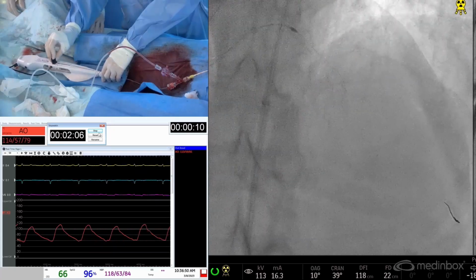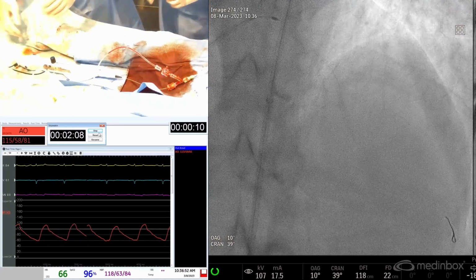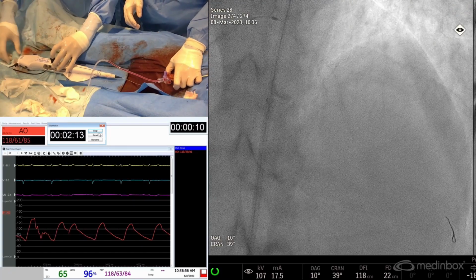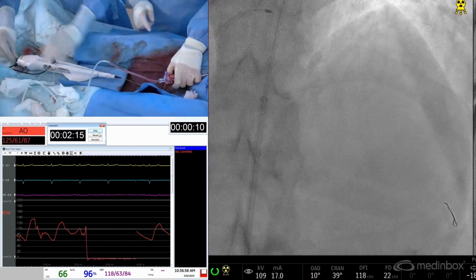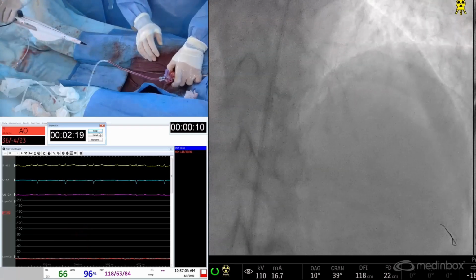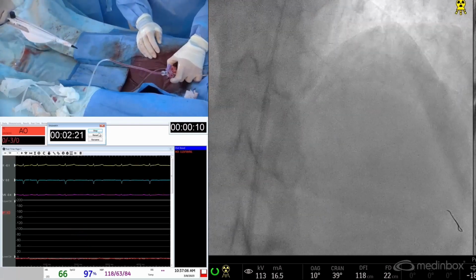You see the noise? Hear the noise? Okay. We're good enough with that. Okay, so we're good. We're going to dynaglide out. So dynaglide mode. Turn it on. Release the brake. And we're just going to switch out.